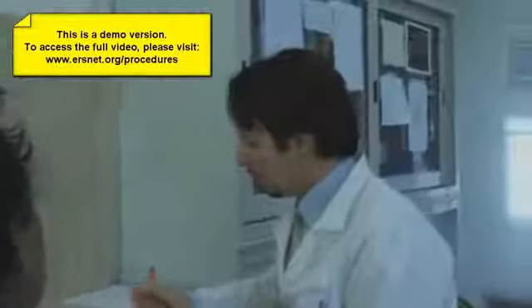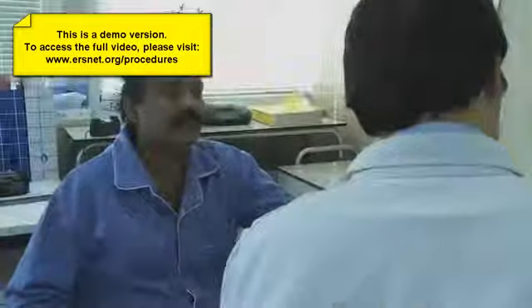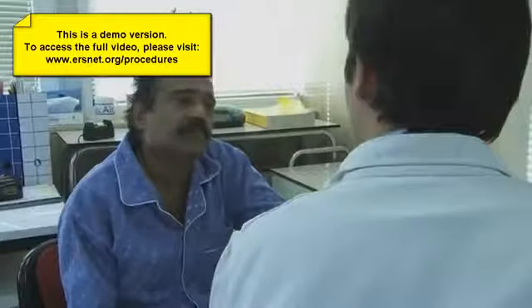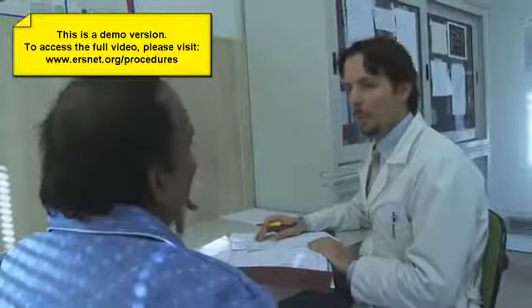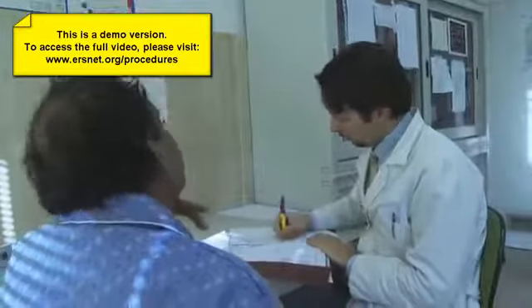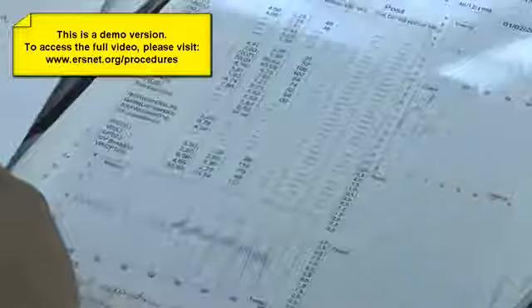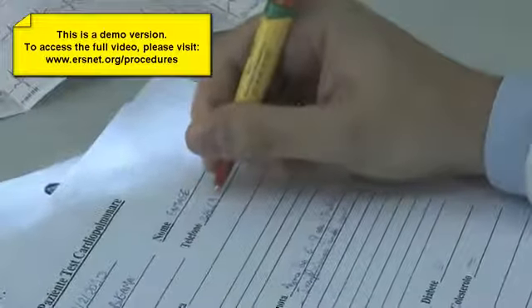At the time of scheduling, the subject should be instructed to adhere to his usual medical regimen, avoid eating for at least two hours prior to the test, avoid smoking and caffeine, and dress appropriately for the exercise test. The preliminary clinical evaluation of the patient should include clinical history including current medications, physical examination, chest x-ray, pulmonary function testing, and electrocardiogram.